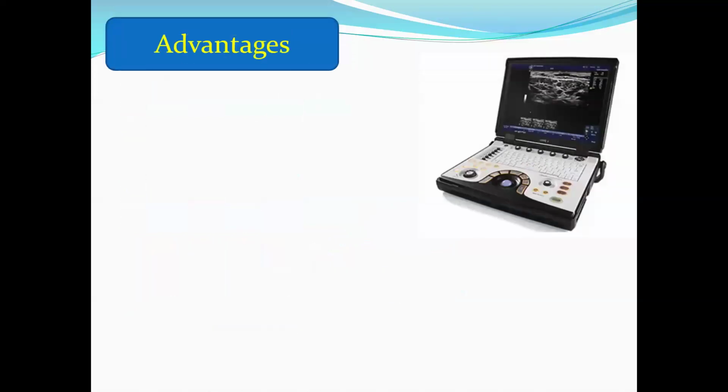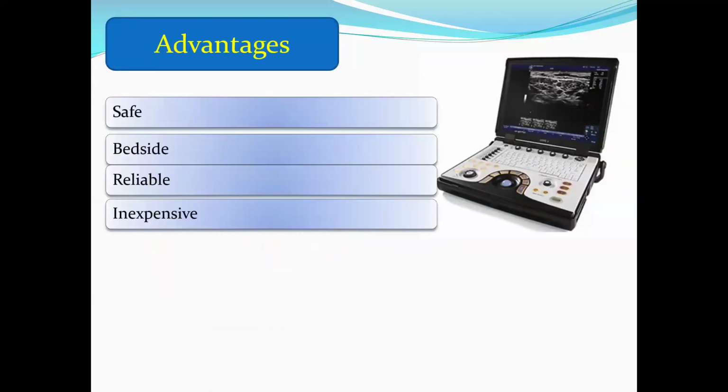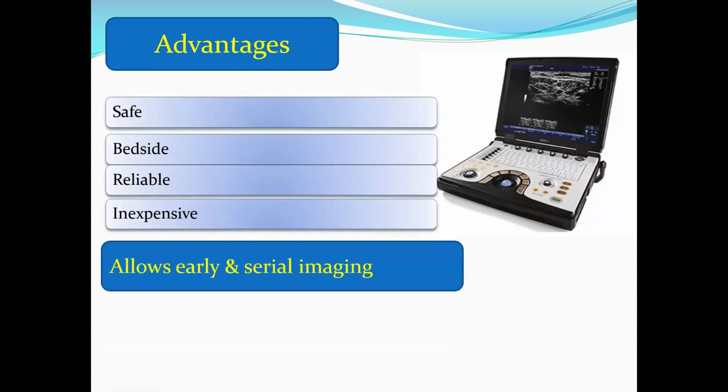What is the advantage of the ultrasound? It is safe, bedside, reliable, inexpensive, and the best advantage, it allows early and serial imaging.